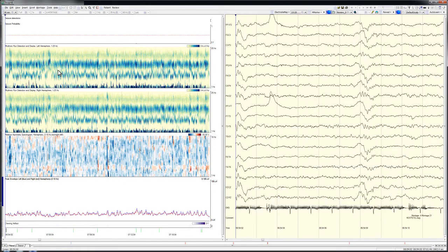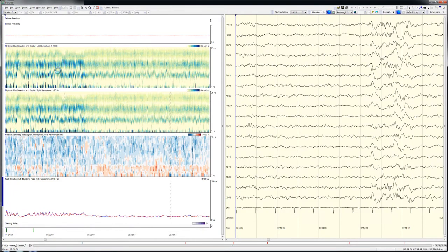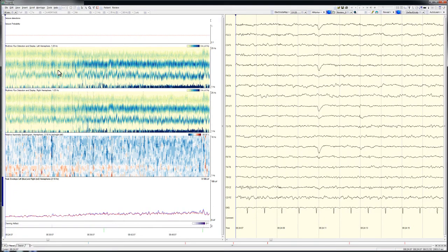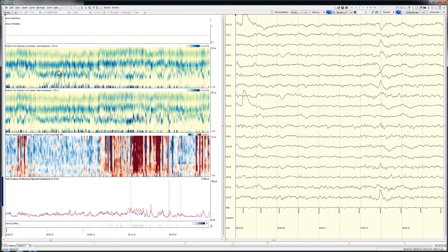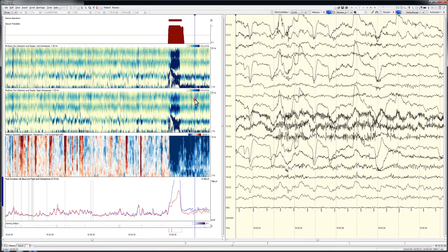I won't show the majority of my review of the EEG trends, but I will highlight some of the findings evident in the trends. Many hours into the record the previously reviewed seizures, the ones that were detected, are again seen in the trends.